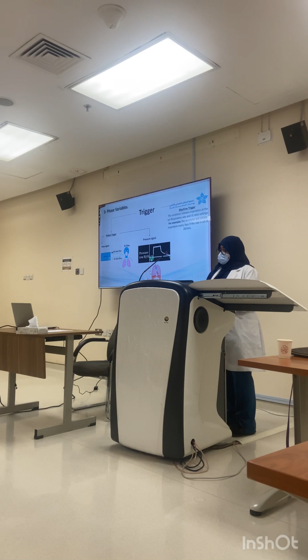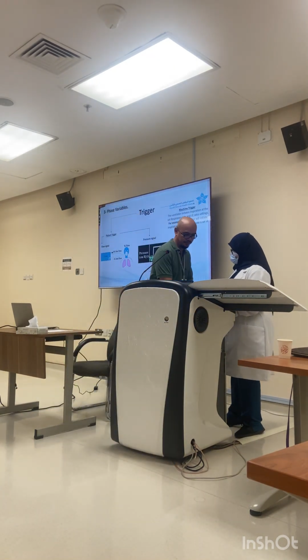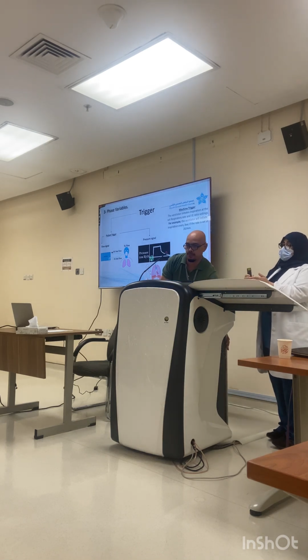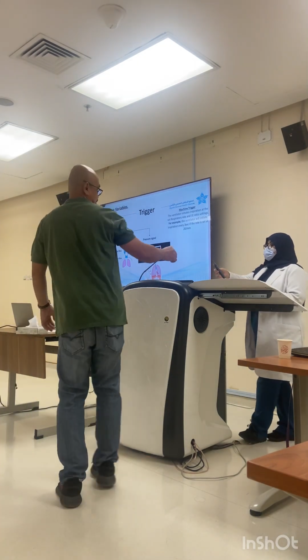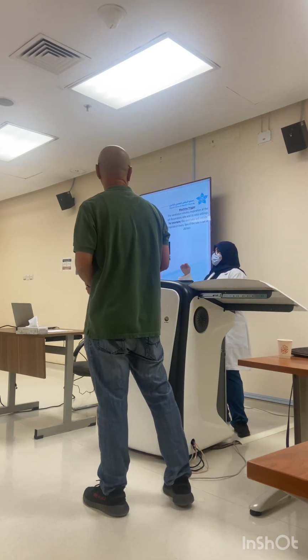Whereas the patient trigger is divided into two triggers. This kind of trigger works based on pressure signal or flow signal. For the pressure signal, the patient will not be able to start the breath unless the patient makes a negative pressure, a difficult effort to deliver the breath. So usually we set the pressure signal as a negative pressure.